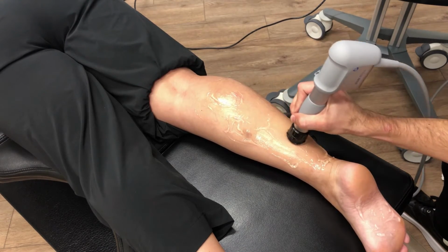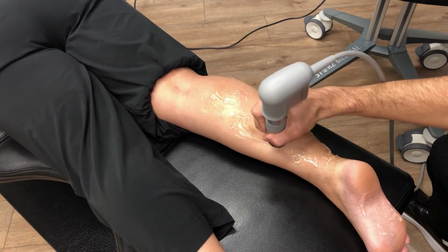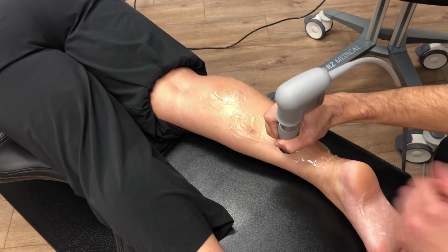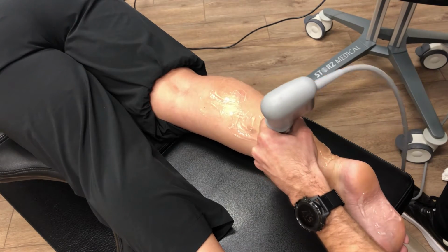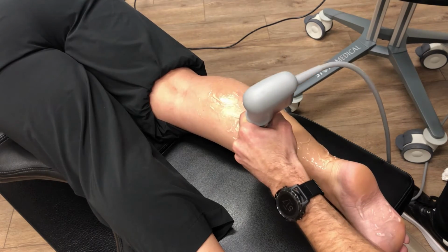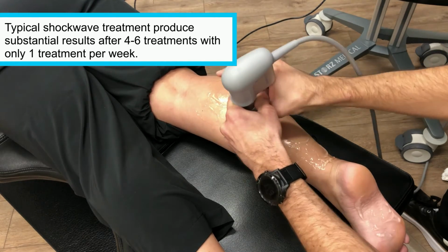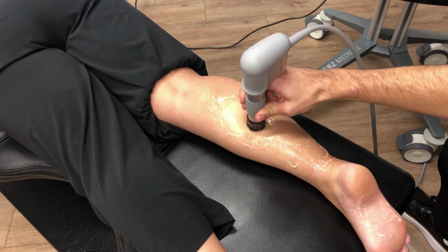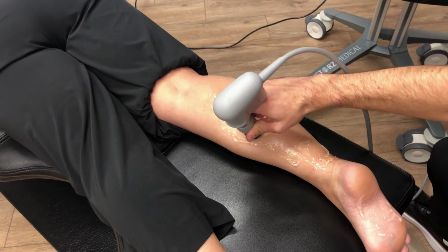Now, shockwave treatments are generally not painful. You feel some pressure from the sound waves, and once you get into areas where there is some myofascial trigger point or myofascial adhesion, you might feel some achiness, a little bit of soreness when you're getting the treatment done. But this is a very effective treatment for musculoskeletal pain, and the treatment protocol is just 1 time a week. Treatment's less than 10 minutes and can often be that next level of care when other treatments like physical therapy, massage, ART, active release technique, if those treatments plateau or don't take care of the issue completely, shockwave is an excellent therapy to try.